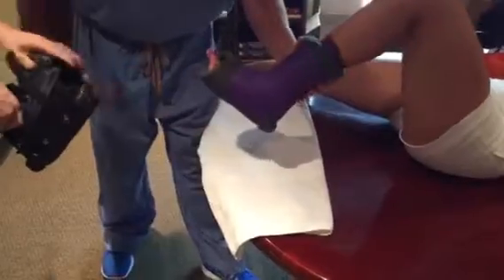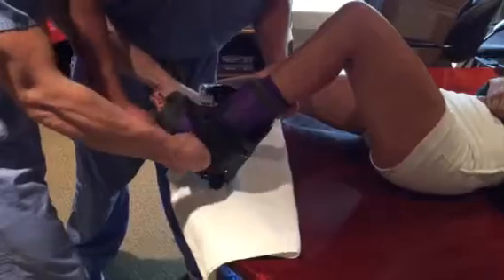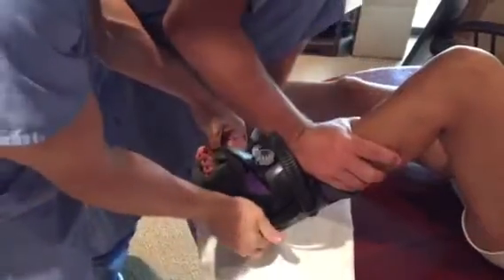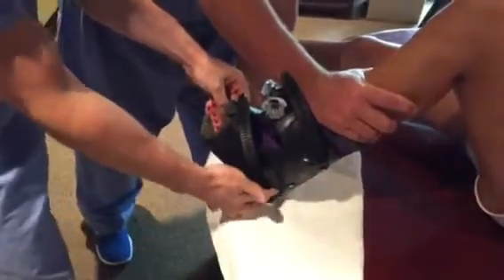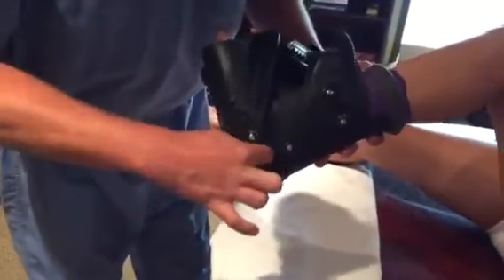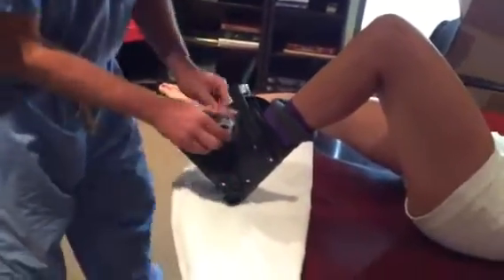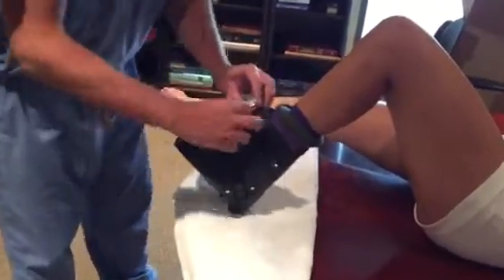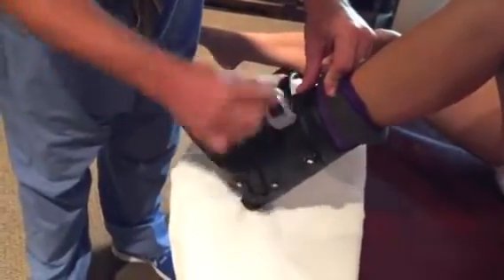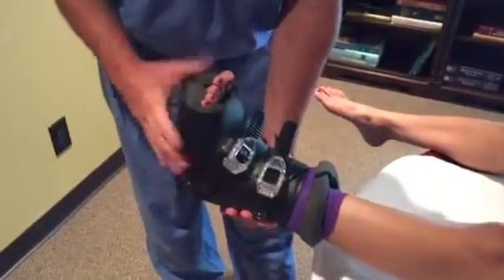My assistant will come in. Patient's foot will come in, and they'll use the table or the spur to make sure that the heel is all the way into the boot. As you can see here, this is your hole and heel is definitely down. They will come in like so, crank that down, crank that down, and attach the boot into the fixation device.